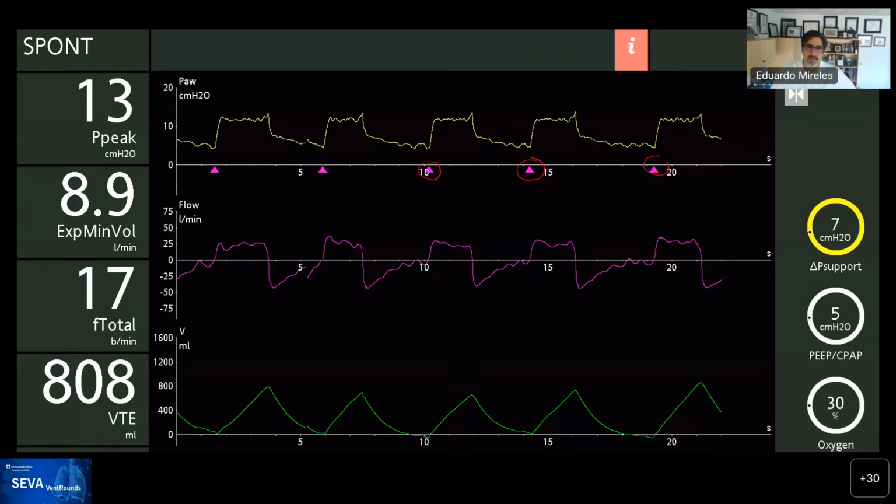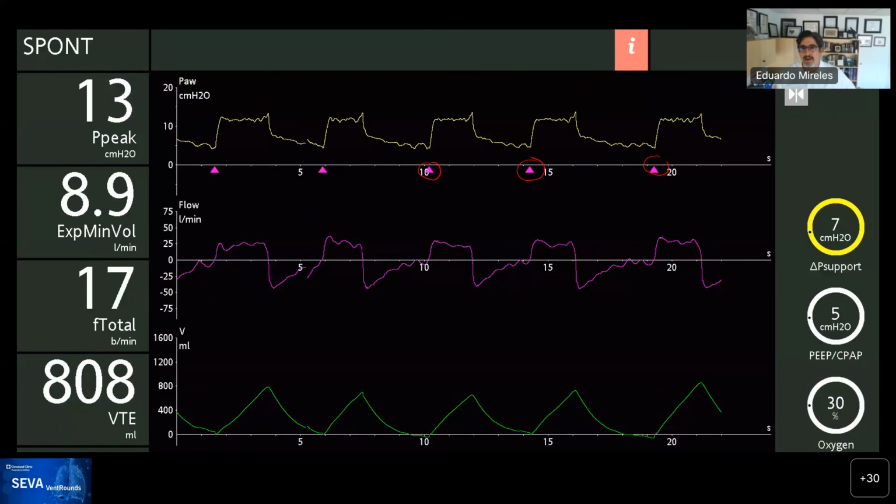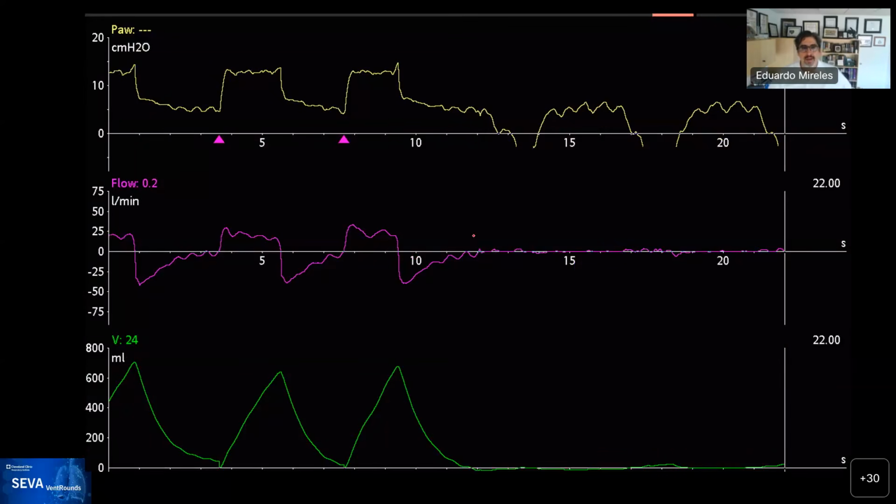So we did an end expiratory pause. And you can see the PMOS goes from here to here with the patient essentially inhaling all this time. And over here, again, this amount of time and not bearing down. So it's the pressure staying at the level of PEEP. So we went from a distressed individual fighting against the ventilator, blowing hard, to a case in which the patient now is doing natural breathing and getting the breath in and not bearing down as the patient is breathing. So I thought that this was a good example for all of us to review.